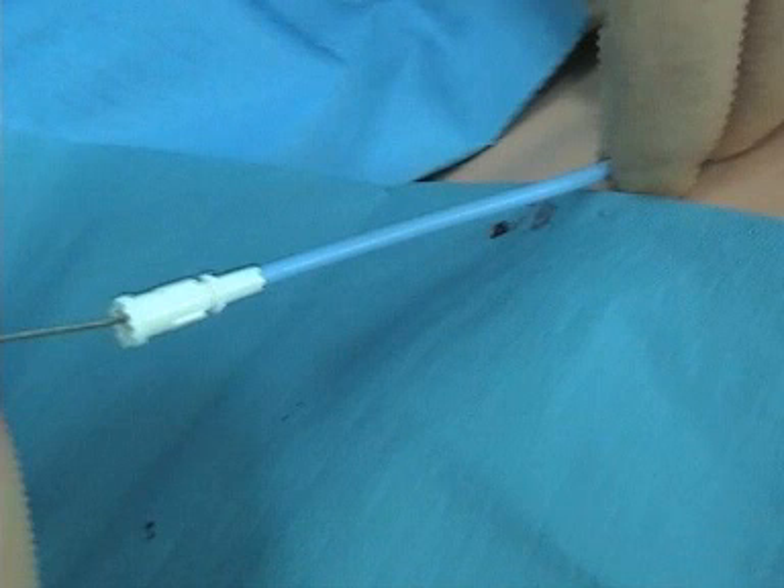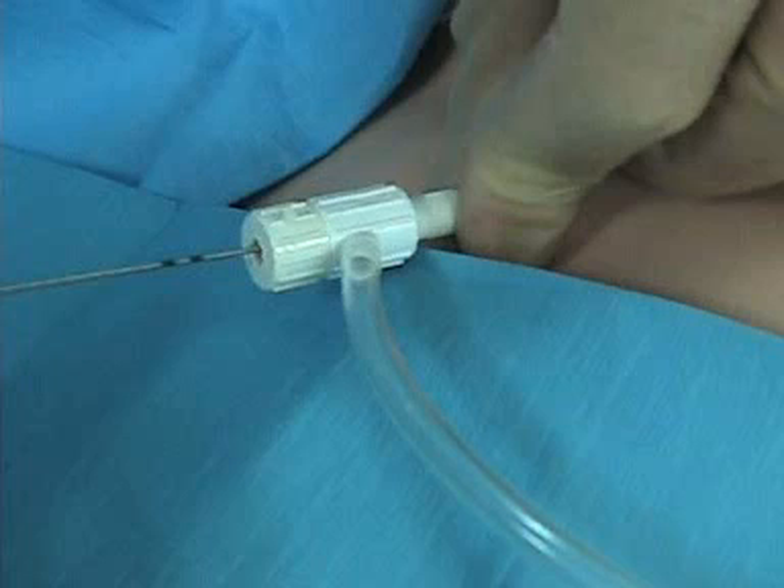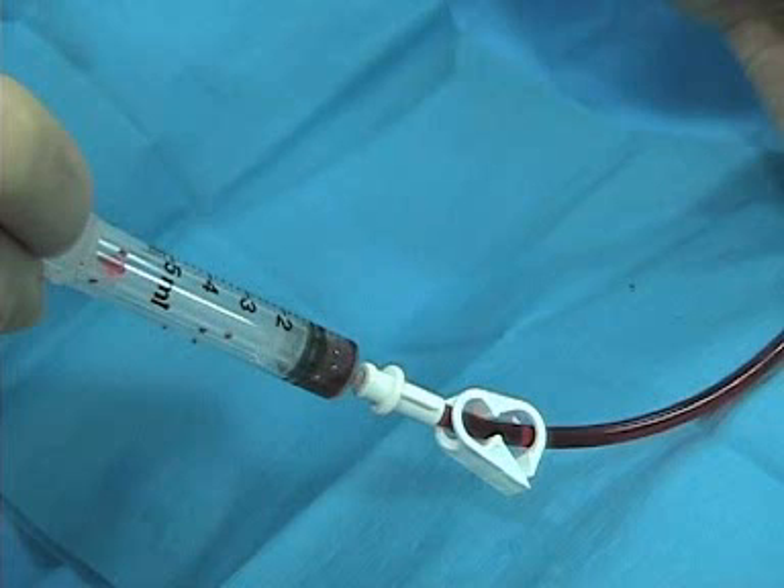When you get jammed between the rib and clavicle, it's very hard to advance any kind of CVP or swan in. Now that we've already done the dilator, we're going ahead and putting in a Cordis introducer here. Slide it all the way in, pull the wire out, then aspirate out all the air and flush.